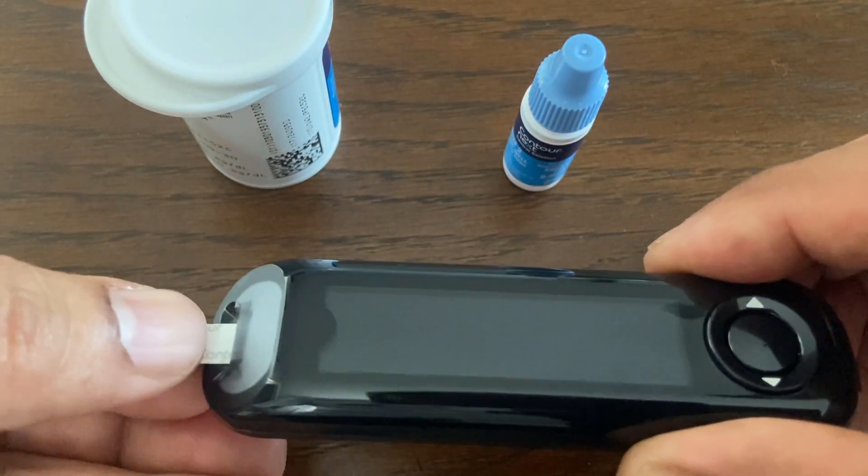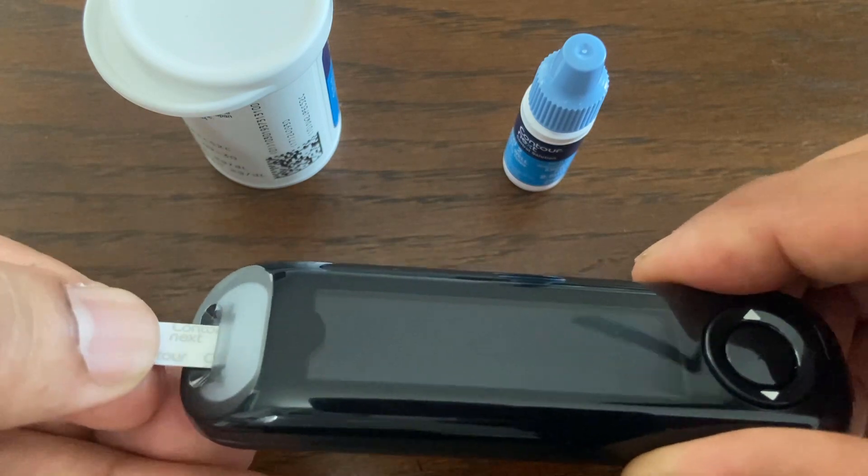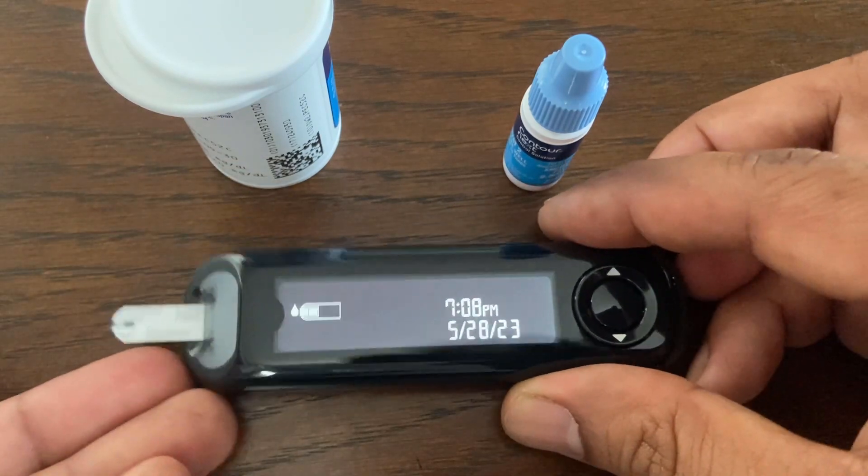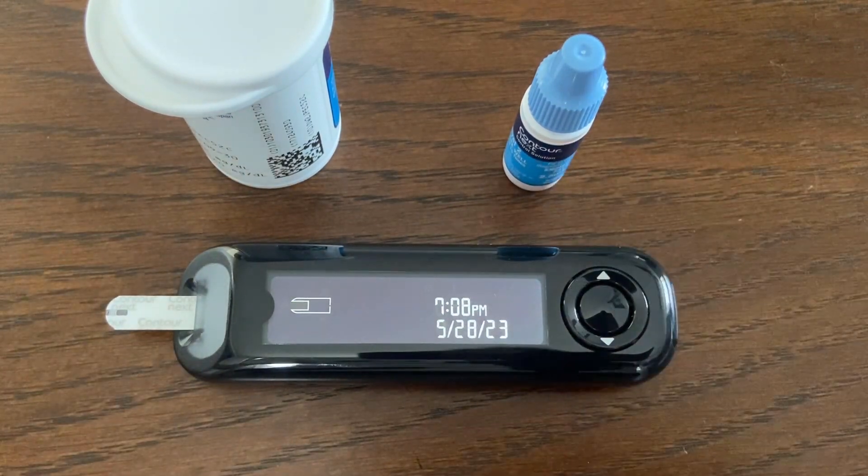To turn the meter on, simply insert the test strip into the meter. Insert the gray square end firmly into the test strip port until the meter beeps. The screen displays a blinking blood drop indicating it is ready to test.